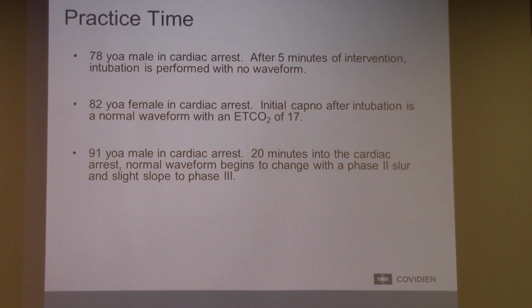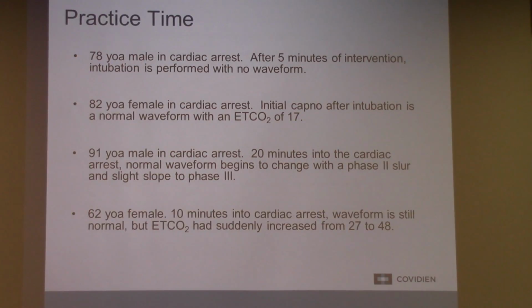Okay, so once you have a shark fin in an intubated patient, suction the tube first. If that clears up the waveform, that was the problem. If it didn't clear up the waveform, then you might move to the whole inline nebulizer thing.